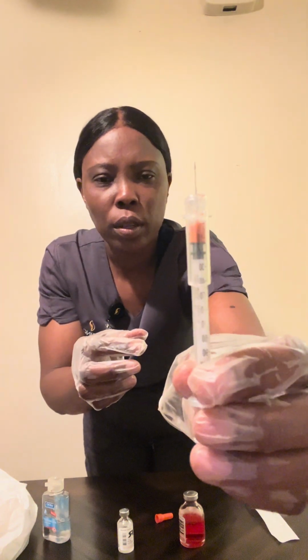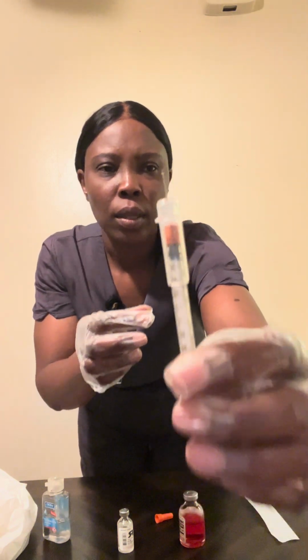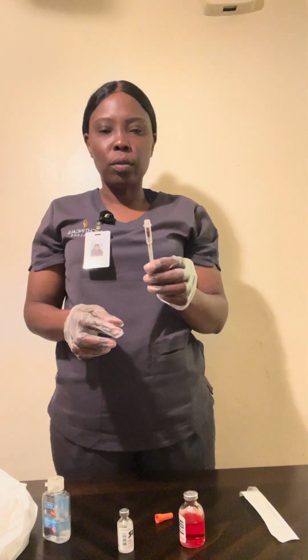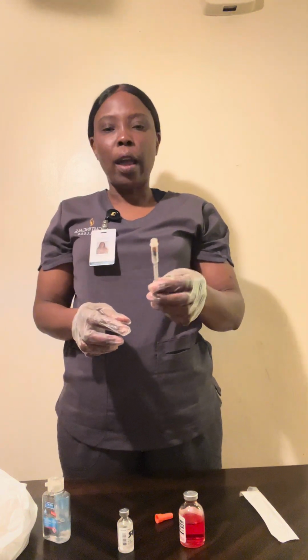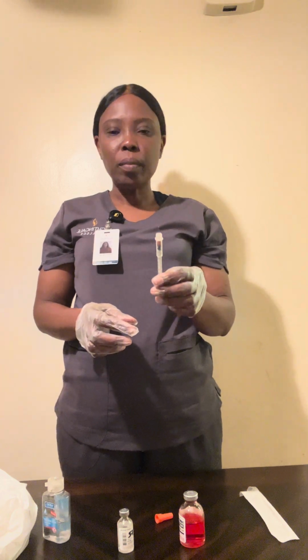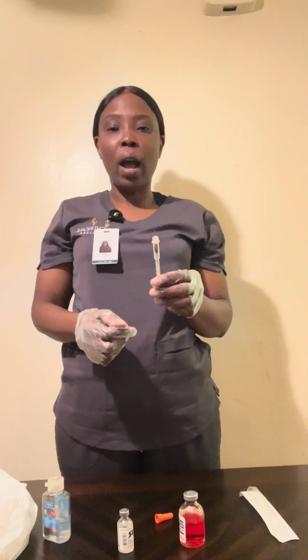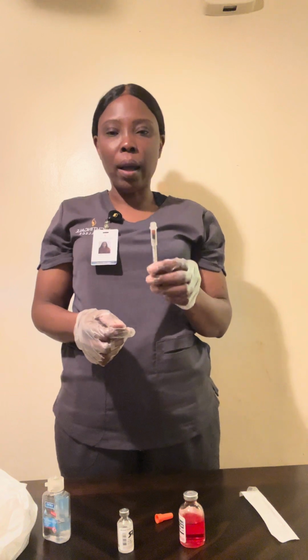This is my 12 units. I'm going to be extra cautious not to overdraw. If I do, I will start everything back over. I will do my dose calculation over, make sure I have 12 units, and check the MAR again.